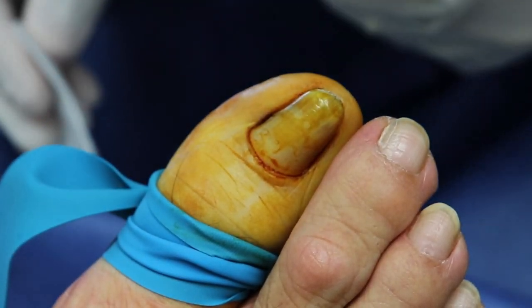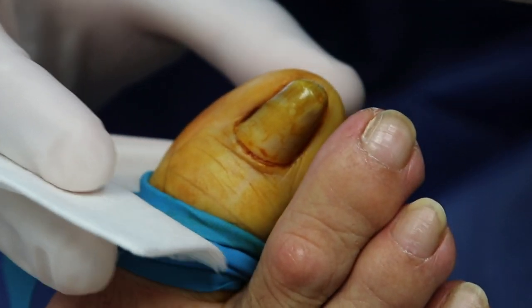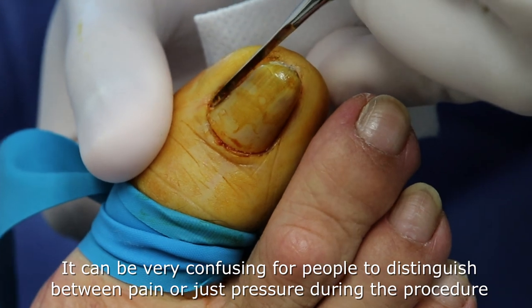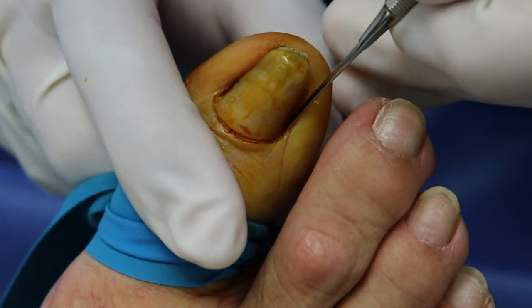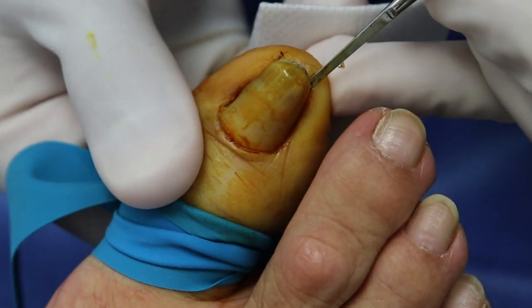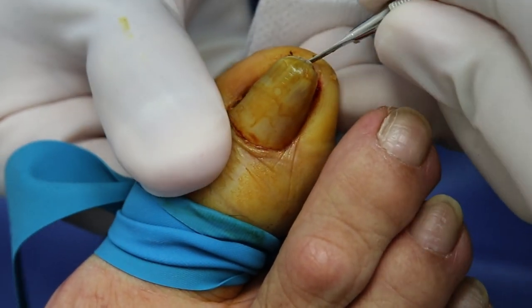We're going to do one last little check to make sure everything's completely numb. Do you feel anything sharp here? No. That one on the side - what did you feel? Here on the side? Was it sharp or did you feel pressure? Try again. Sharp? But you're on the other finger - there's nothing sharp there. How about here? Anything sharp? Nothing. You should be able to feel things touching you but nothing that makes you say ow. Anything here? Nothing. On this side? Nothing. You're good.